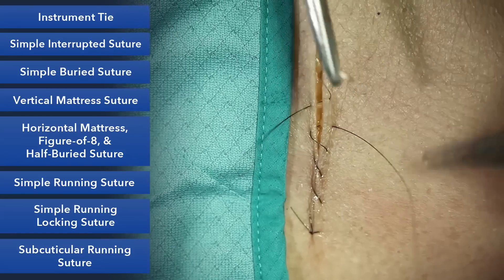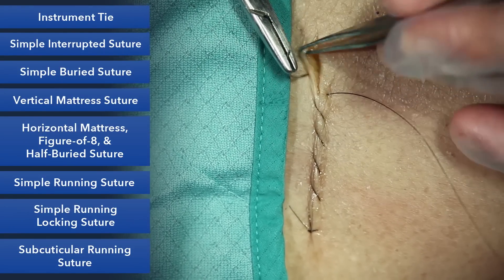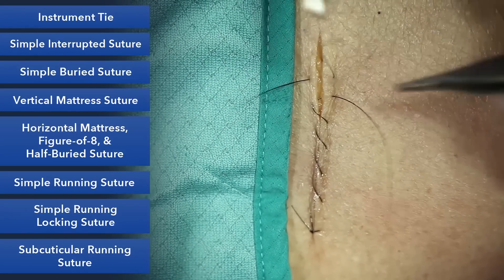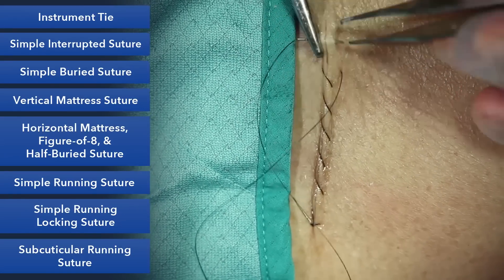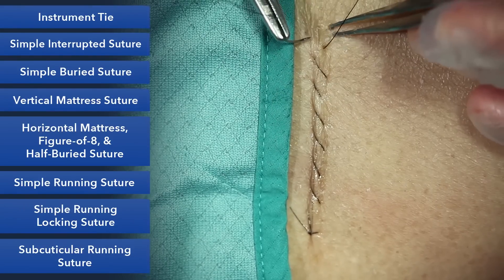Notice I'm exaggerating my 90 degrees because I want this to evert. If I go too far back on the skin or I take too shallow a bite, I'll end up inverting the skin and it won't heal correctly. Notice also I'm just pulling up enough on the suture so that the skin edges touch. Pulling up on the suture very hard is just ischemic and can cause bad scarring.